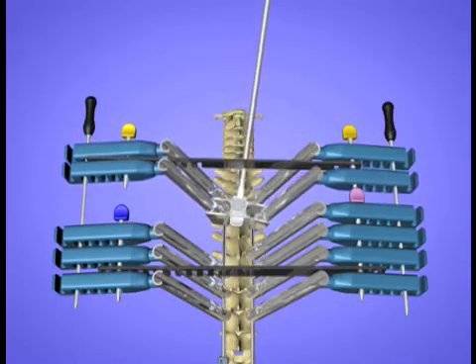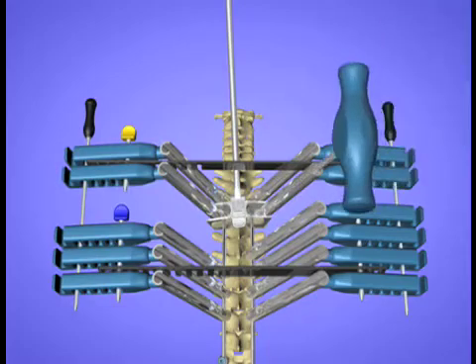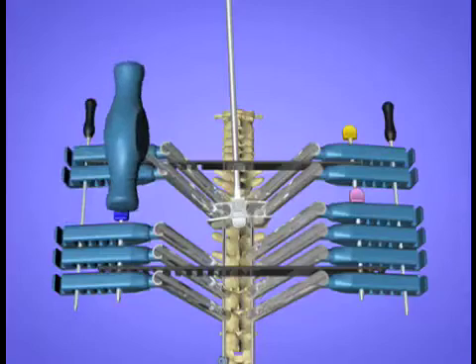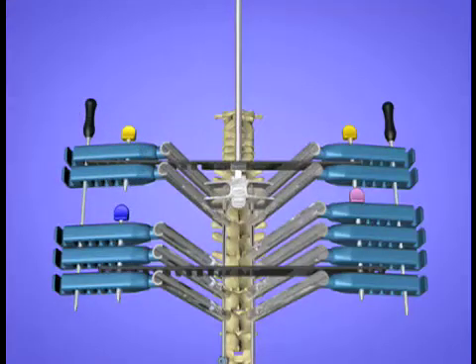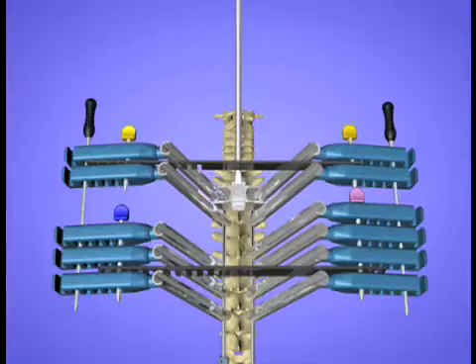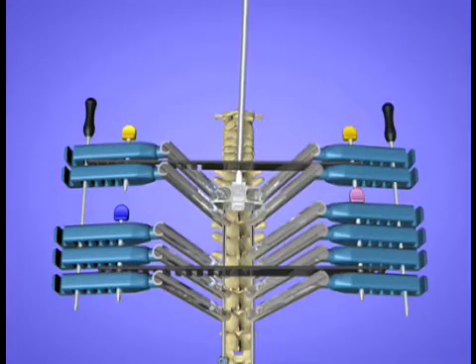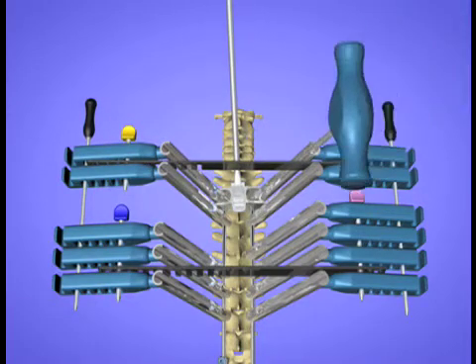Horizontalization is completed with the small horizontalizer, and the plugs are tightened with the torque driver.